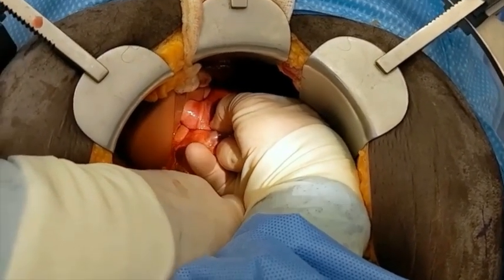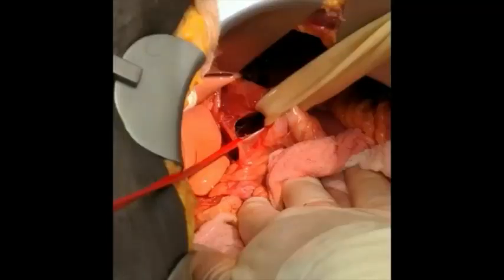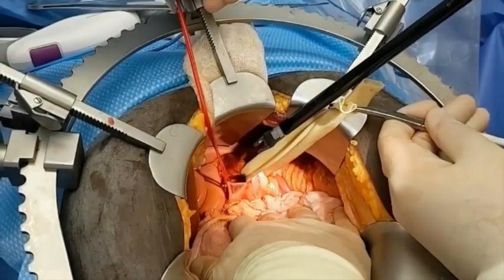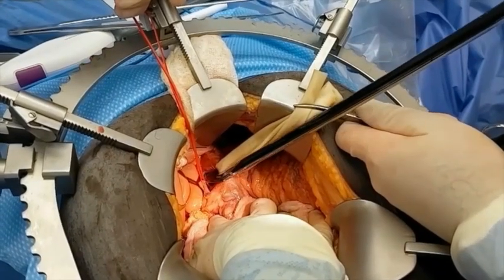Exposure and identification of the posterior vagus is often much more difficult. However, it can be palpated behind the esophagus as a guitar string. The posterior vagus is bluntly dissected off the esophagus, and a Penrose drain is passed around the esophagus, allowing for lateral and inferior retraction of the gastroesophageal junction.